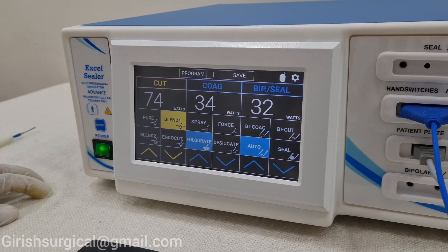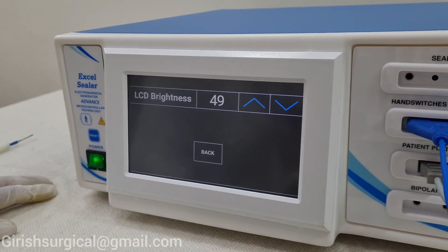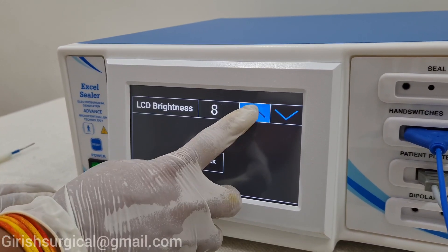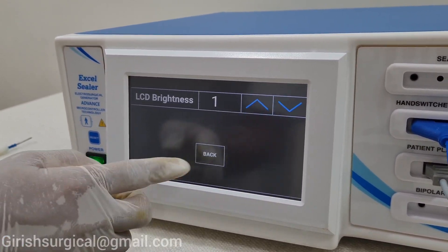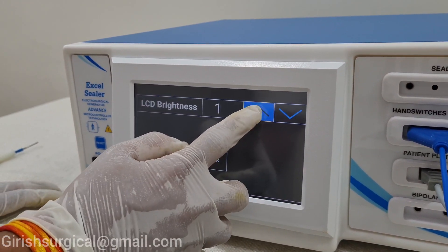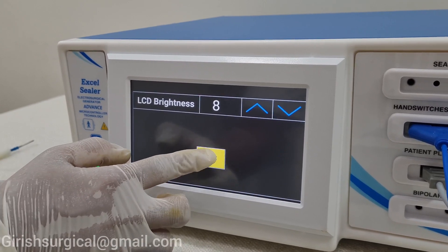This is how we can set the program. In the second part there is a settings mode. If you want brightness, you can increase the brightness accordingly. If you want lower brightness, you can press and go back and the brightness will remain the same. On settings again, I will increase the brightness — it will go to 8 and it is done.